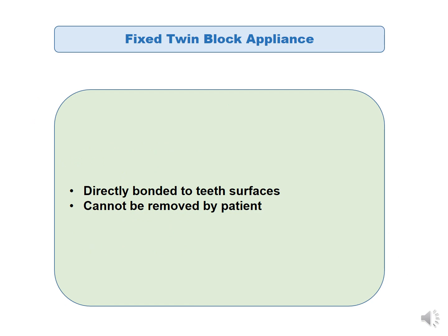Now the twin block can also be modified into a fixed twin block, whereby the appliance is directly bonded to the tooth surfaces and cannot be removed by the patient.